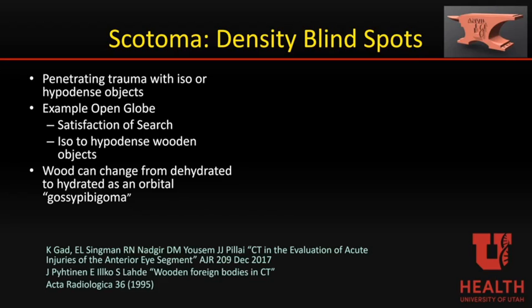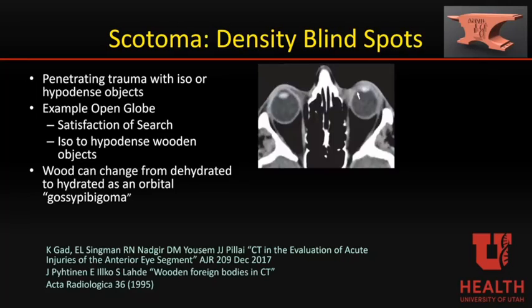If we think about other blind spots in our technique and our methodology, there can be blind spots due to density. So frequently a penetrating trauma with an iso or hypodense object may be hard to perceive.